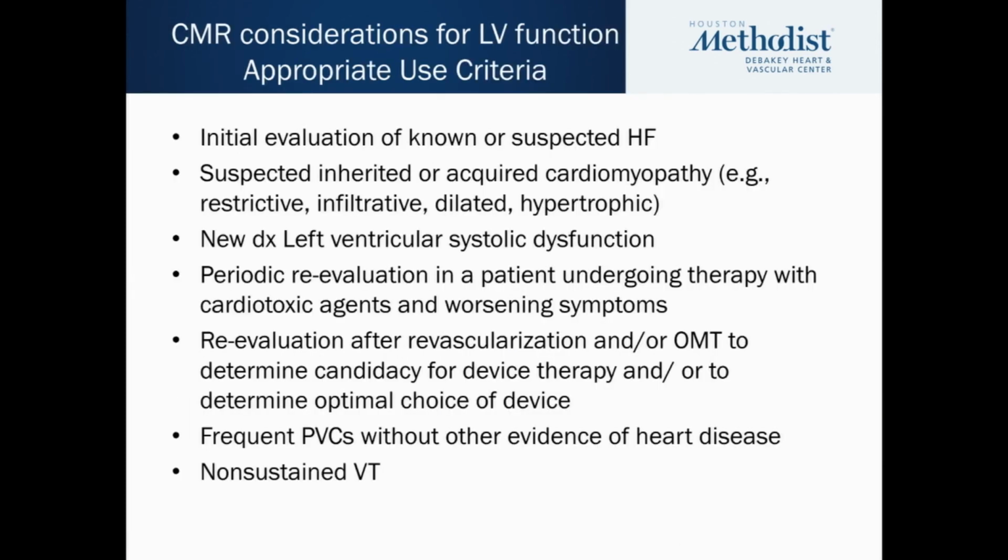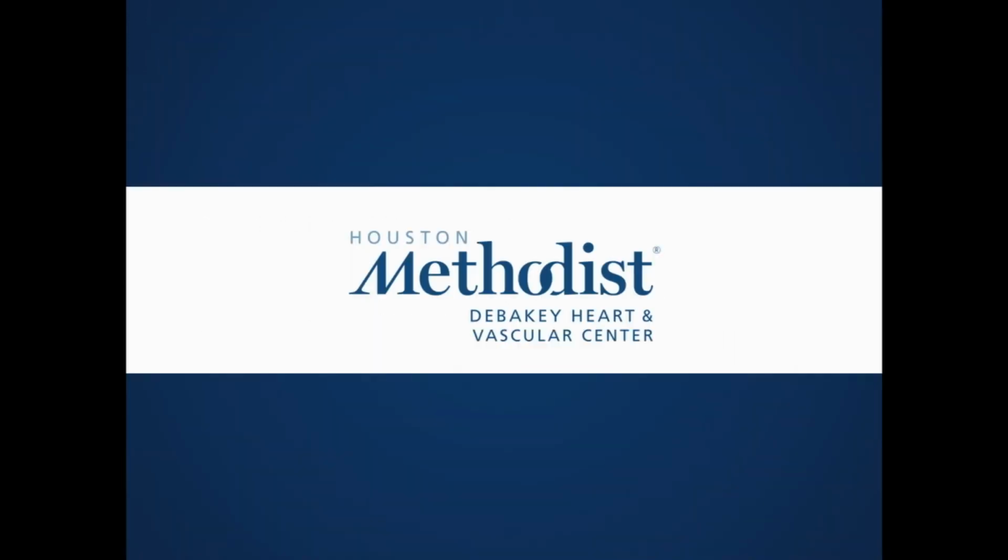Keep these indications in mind. CMR is one of the best ways to look at someone with a new diagnosis of heart failure or suspected heart failure, new LV dysfunction, and as you all know, following patients, for example, who are getting cardiotoxic agents, and those with VT and other serious arrhythmias. All right, let's see if there are any questions.